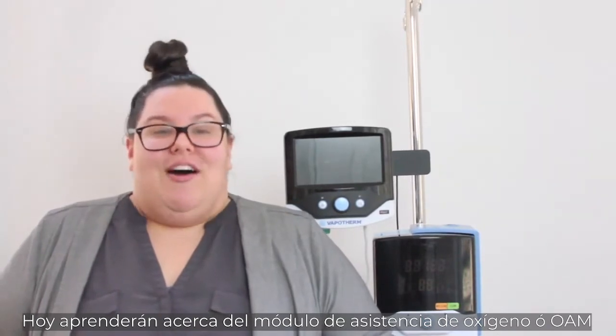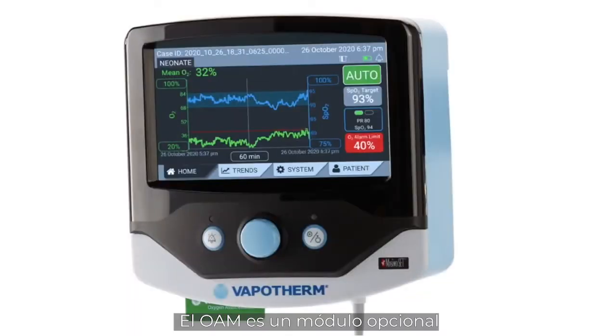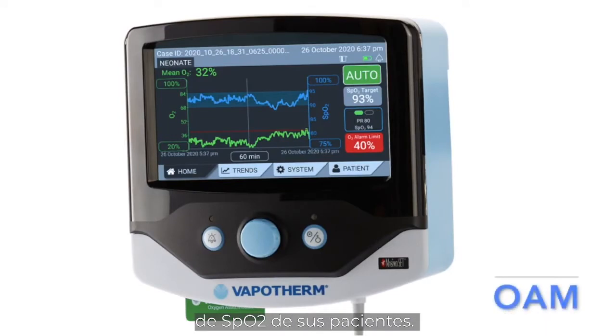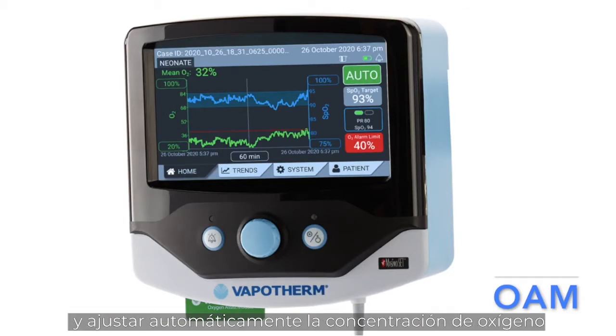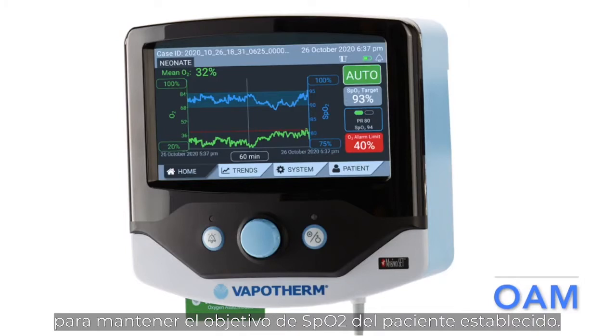Today you will learn about the Oxygen Assist module, or OAM, for Vapotherm's Precision Flow system. The OAM is an optional module used only with the Vapotherm Precision Flow to aid clinicians in maintaining a patient's target Spo2. It uses a proprietary feedback control algorithm to monitor a patient's oxygen saturation and automatically adjust the oxygen concentration provided by the Precision Flow to maintain the patient's Spo2 target as set by the clinician.